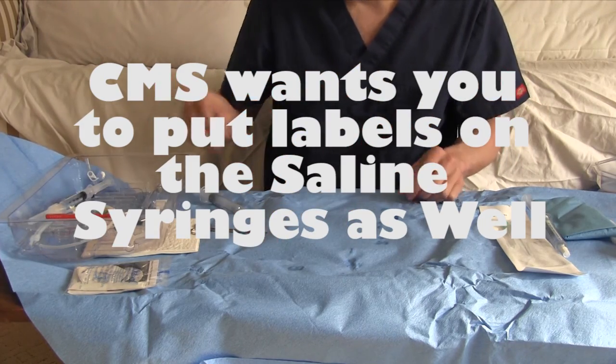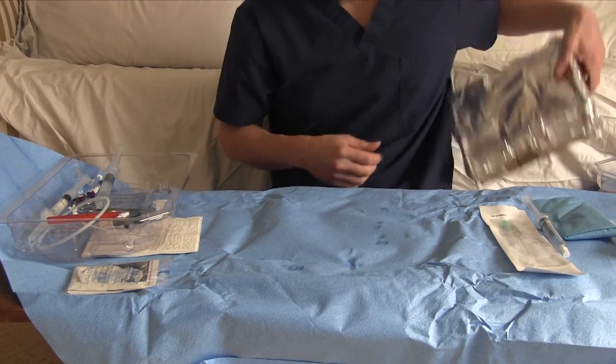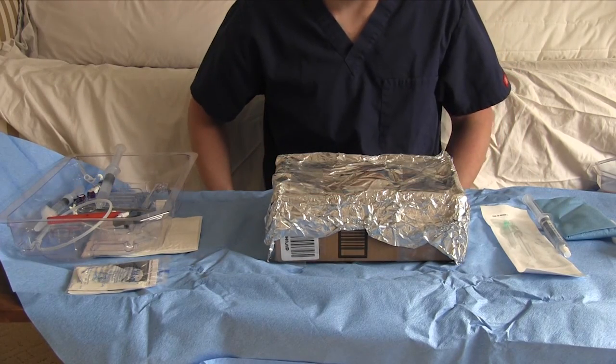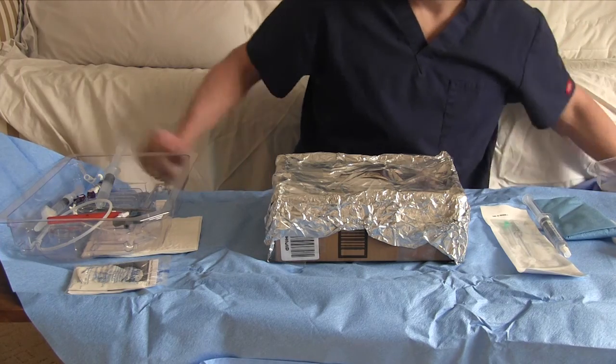Okay, so now we're pretty much ready to go. I'm going to take you through the procedure with this kind of box here in lieu of the arm, and we'll drape it, make it look good.